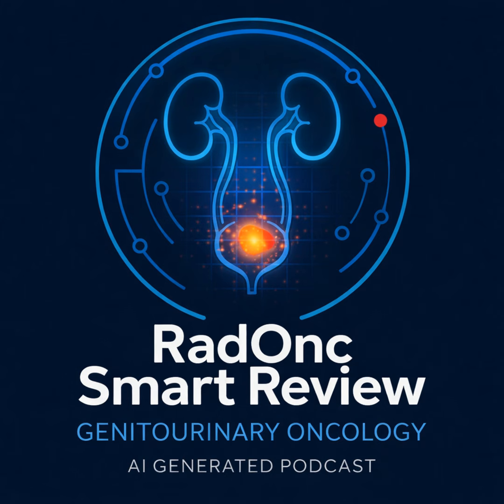This is where image-guided radiation therapy, or IGRT, becomes a matter of life and death. We don't just rely on lasers and skin marks. No, we acquire a cone beam CT scan, a 3D volumetric image, while the patient is on the treatment table mere minutes before we initiate the radiation.